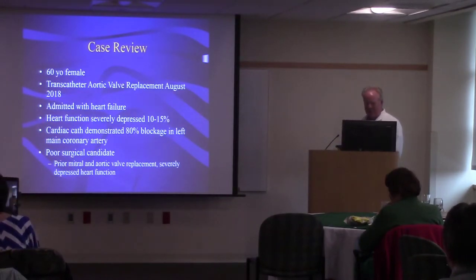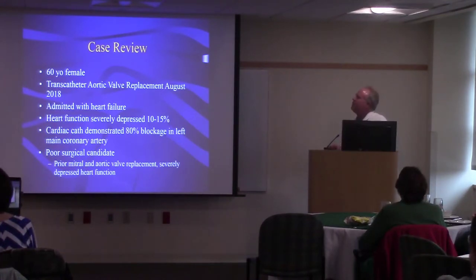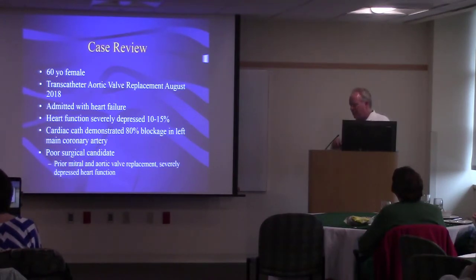Another case I want to talk with you about is a 60-year-old woman we treated here a couple months ago. She had a transcatheter valve placed in August. So she had a narrowing in her heart valve, so we went in with a catheter. We replaced her valve inside her heart by using a catheter technique similar to what I just described to you.